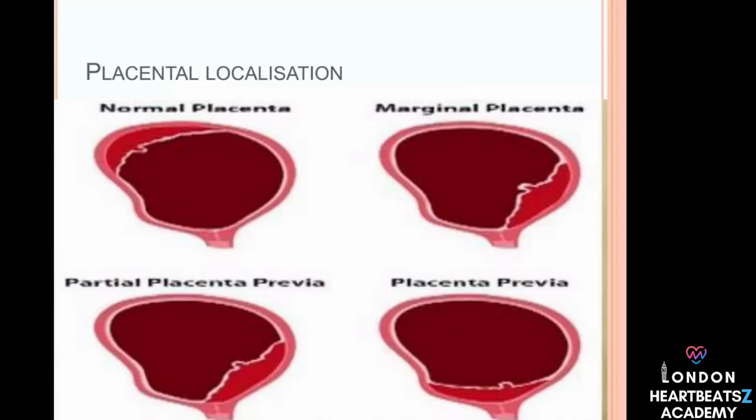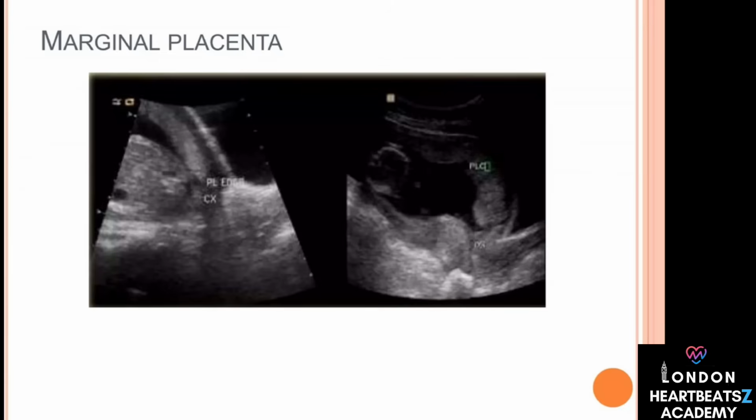The sources on placental ultrasound provide a broader context of other abnormalities detectable as well, including not only previa but also conditions like placenta accreta, where the placenta grows too deeply into the uterine wall, placental infarction, areas of tissue death within the placenta, and various morphological abnormalities, meaning issues with its shape or structure. They also describe the normal appearance of the placenta on ultrasound, typically a relatively homogeneous texture with a clear hypoechoic, darker retroplacental space behind it, and link these visual findings to their clinical implications.